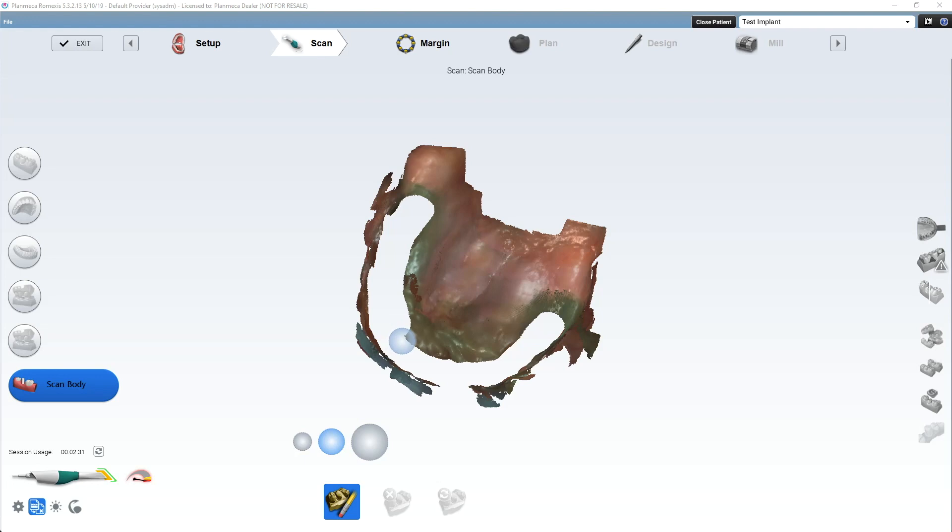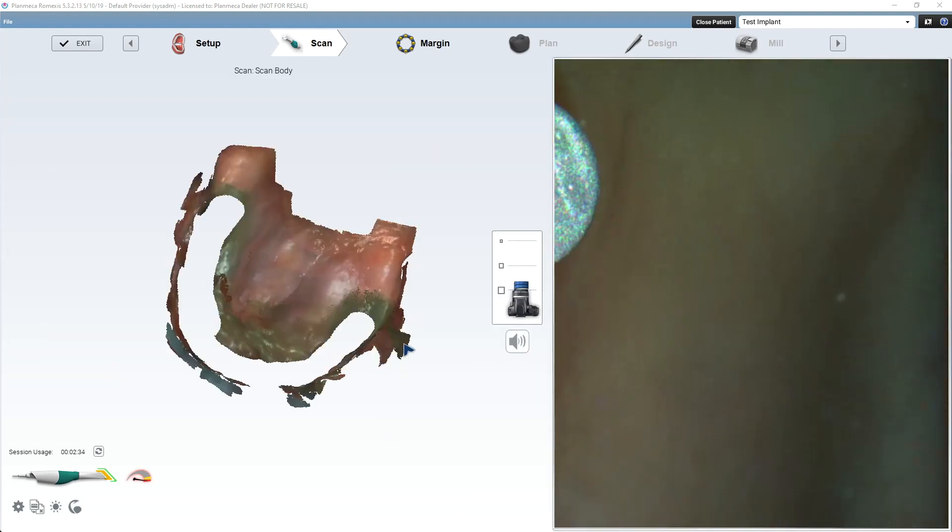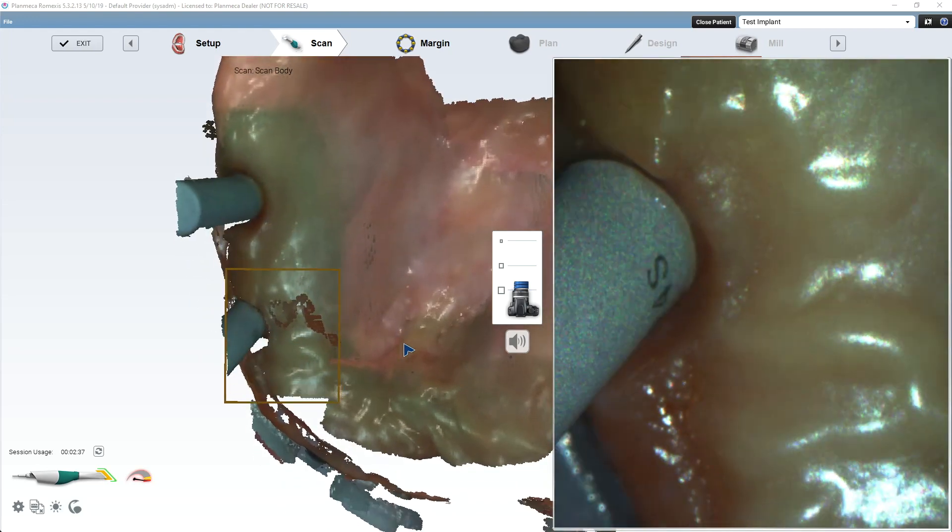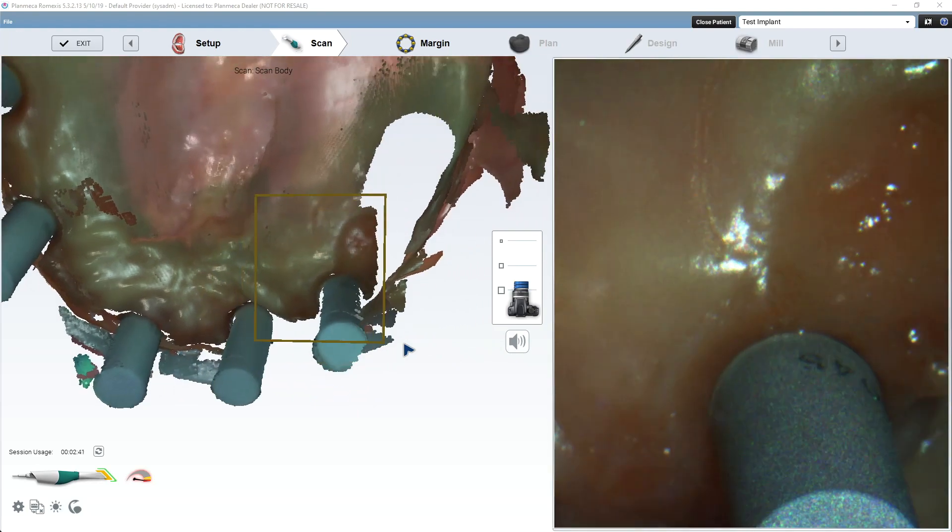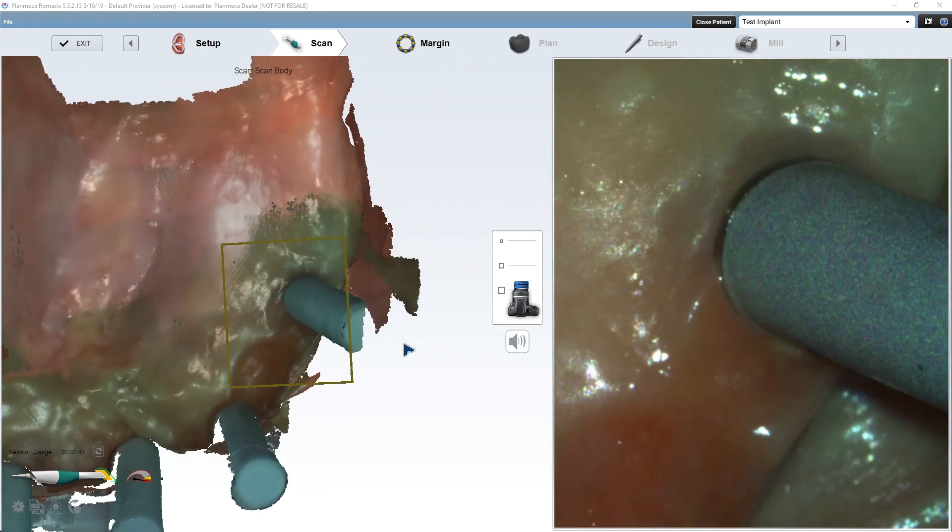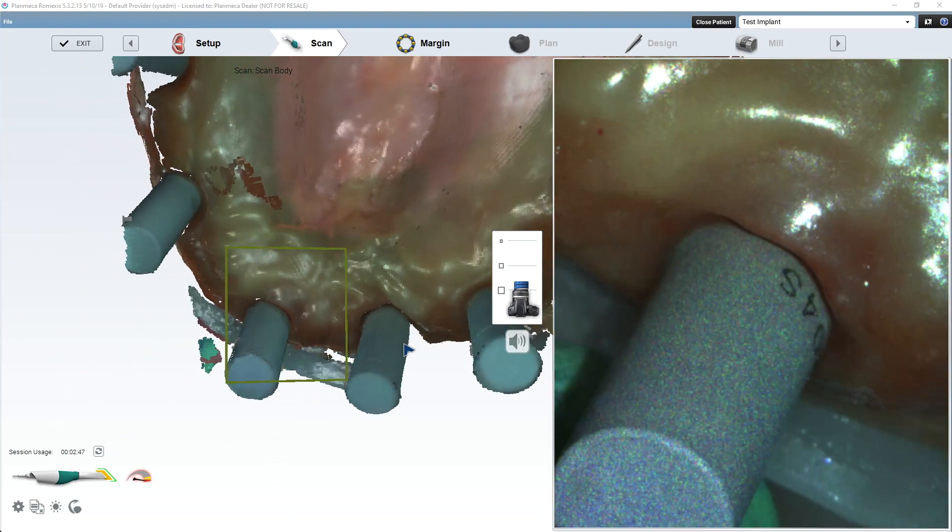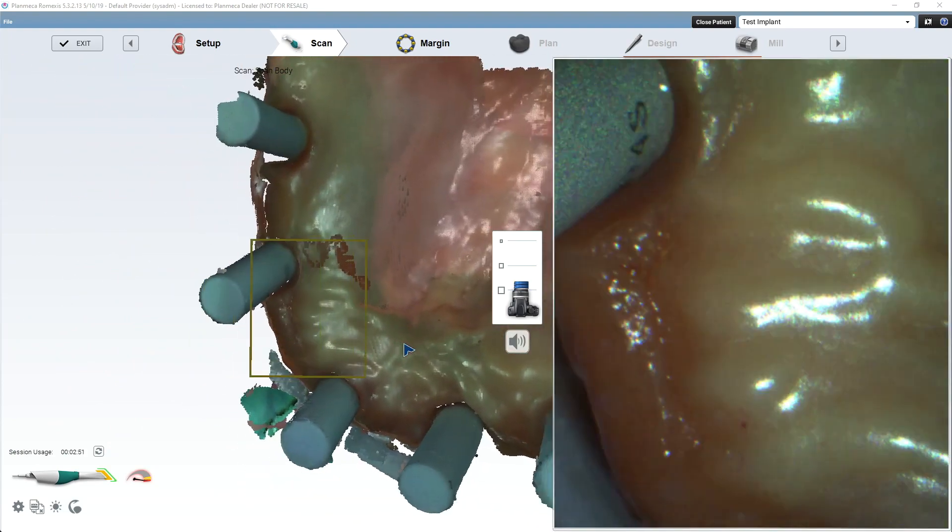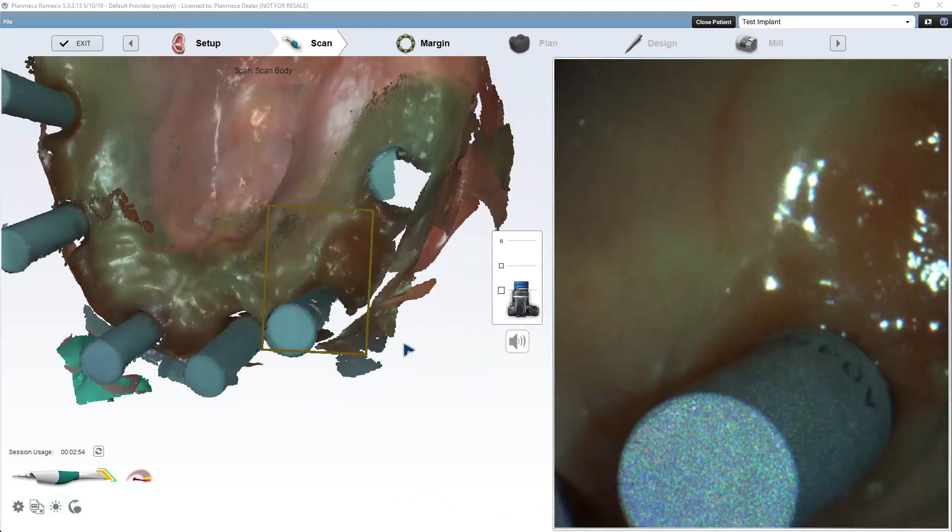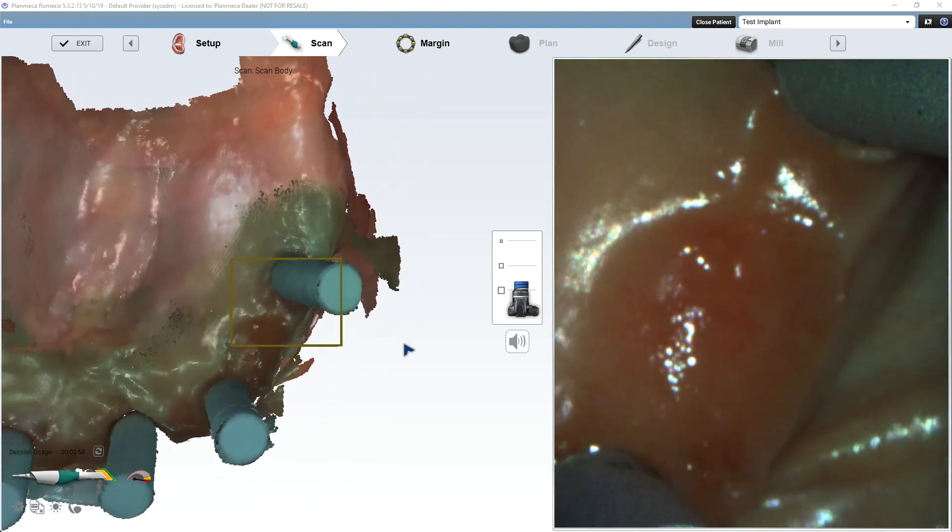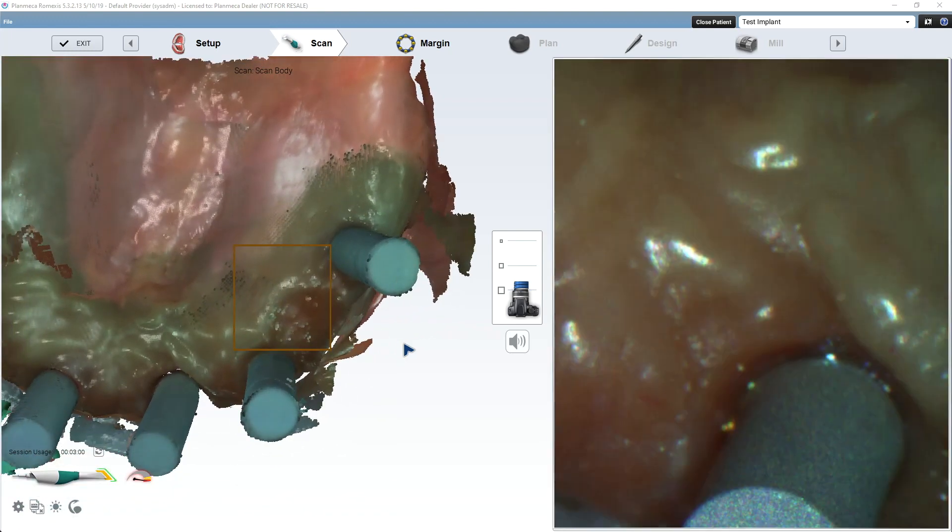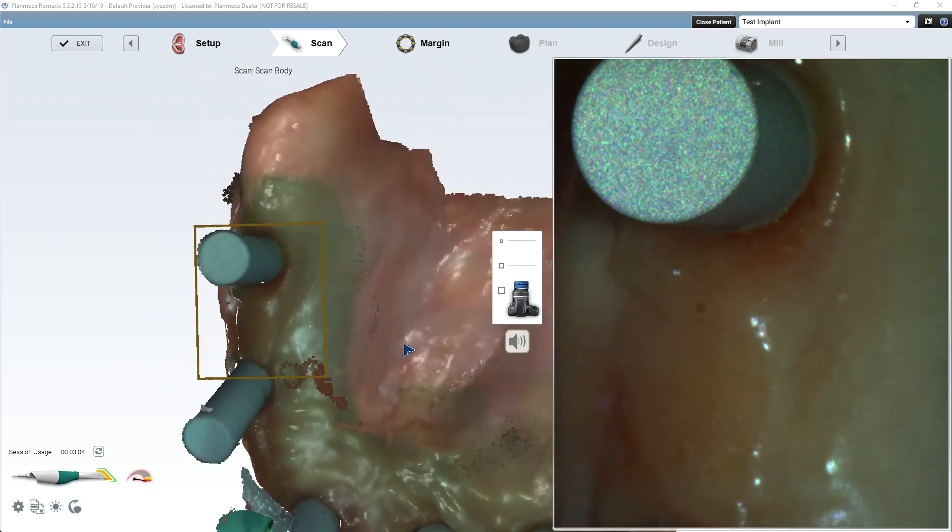So now we're going to go to the Scan Body tab. It's going to copy the upper jaw in, and we're going to re-delete the provisional, and we're going to now scan our scan bodies. Now, I will say that the Emerald S is going to have an update that's going to improve this, but right now scanning multiple parallel scan bodies is kind of difficult. And I don't even know if it's something that I would recommend quite yet. It's just a little bit of a challenge not to get shelling or... Especially these scan bodies. They're just cylinders.